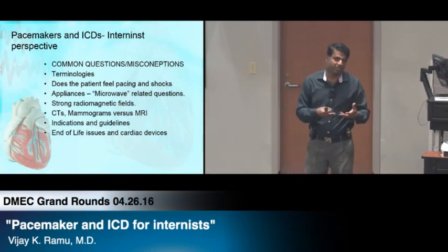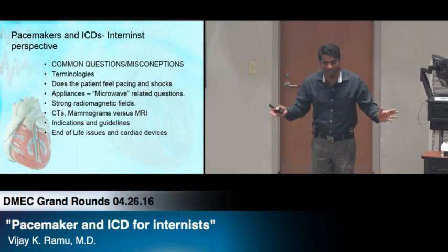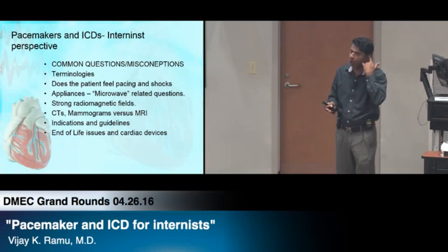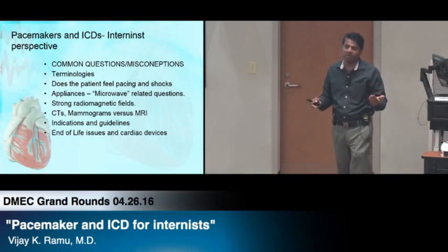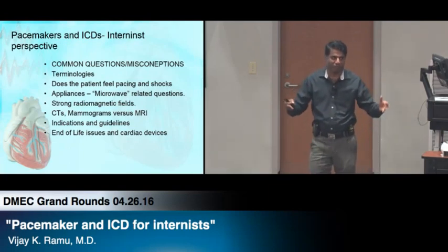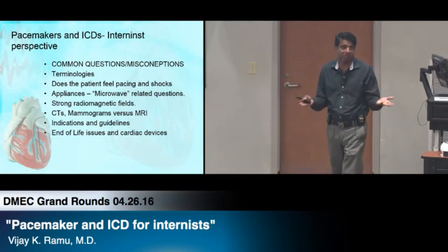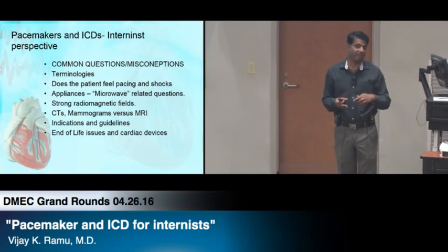Rarely do patients feel just the pacing heart rate going fast, but if anybody says they do, that's what you want to think about. Now if a defibrillator is shocking, 99% of patients feel the shock. Actually, there's one patient in my clinic last week who had a shock in the middle of the day and didn't feel it. That's very, very rare.